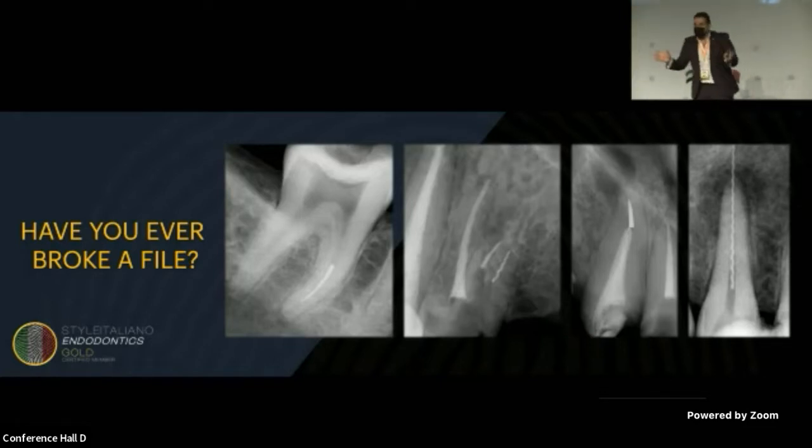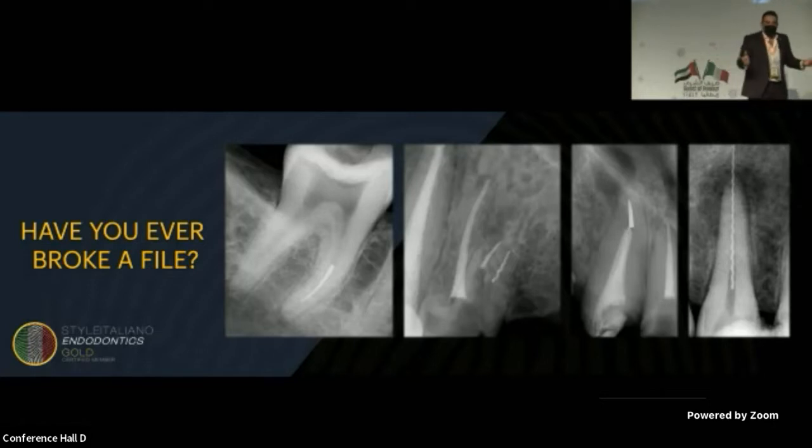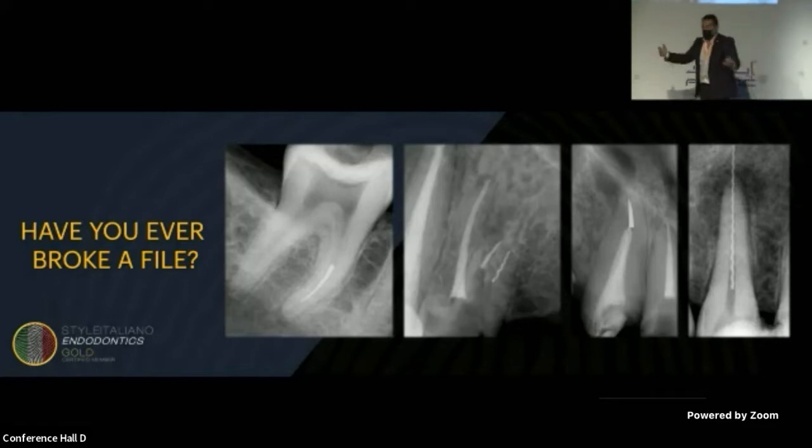Can I ask all of you, have you ever broken a file? Sure, everyone is breaking files. Very few will say no, and whoever says no mostly didn't do many cases of root canal treatment. So if you're working, you will have a fracture.